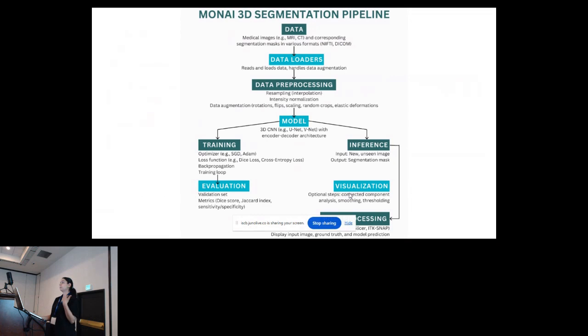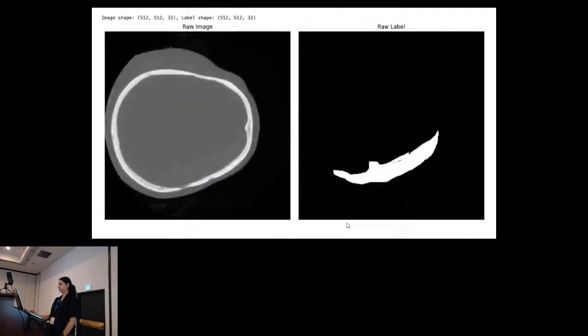Basically, the model will tell us where the region of interest is, and what the volume of the blood is in that region of interest. So we train it, and then we evaluate it using some metrics, and that's what we're going to see next.